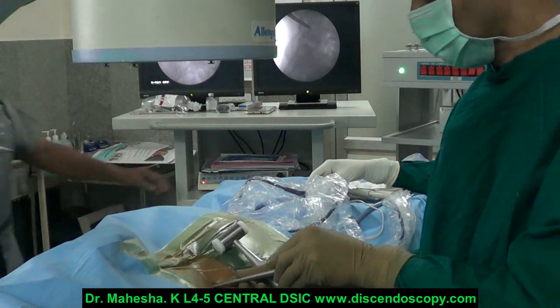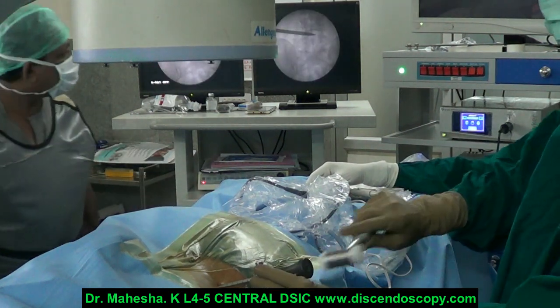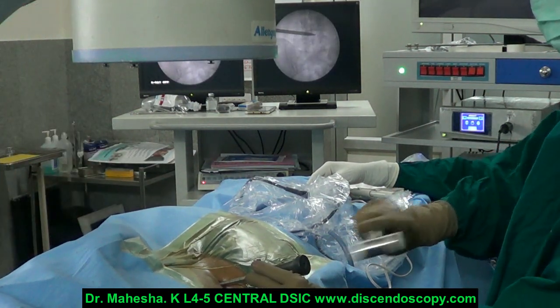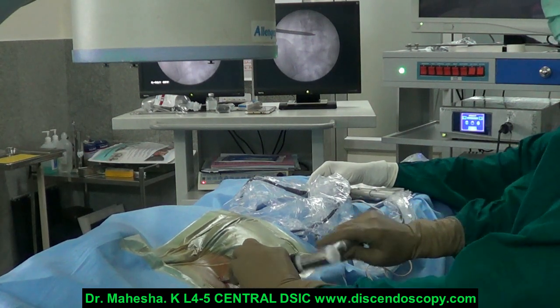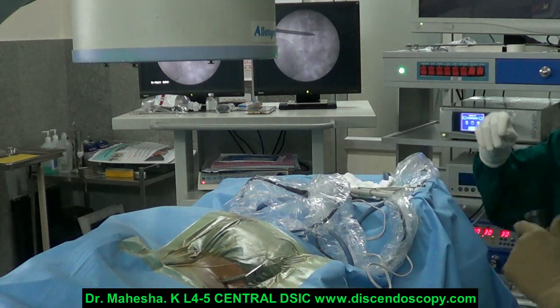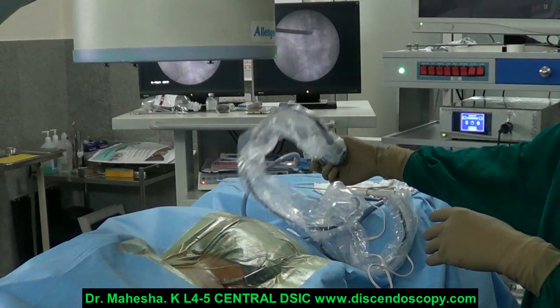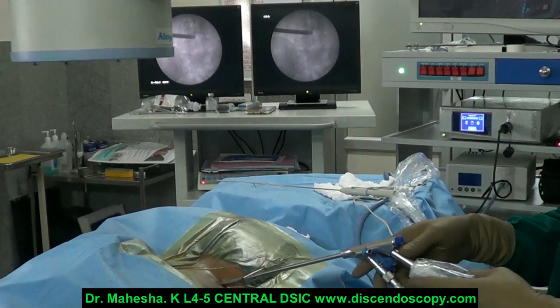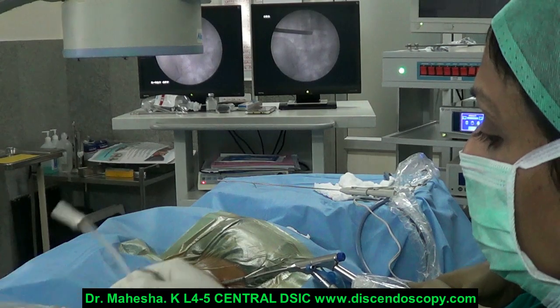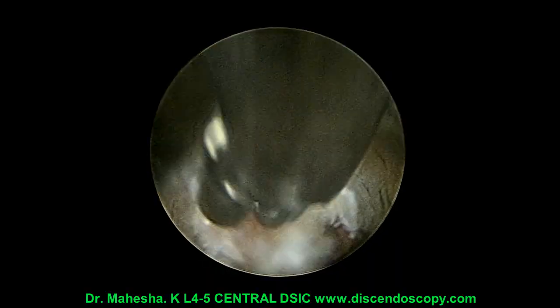Then I insert this cannula with the bevel facing towards the head over the dilator into the disc space. And once you reach the disc space, you rotate the cannula so that the bevel is facing up. Then the dilator is removed and the endoscope is inserted. We are seeing the endoscopic pictures now.